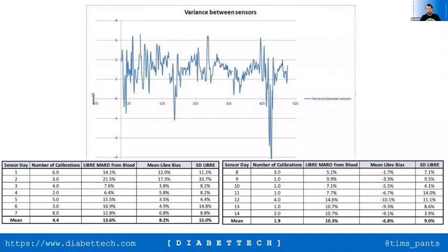If you look at the way Dexcom uses smoothing in their data on their app, Dexcom smoothing is always retrospective. You get a blood glucose data point, and then smoothing has to be retrospective because you can't smooth something you don't know about yet. So I'm not 100% clear on how the extra smoothing works within xDrip. If anybody on the call is and can talk about it, fair enough.